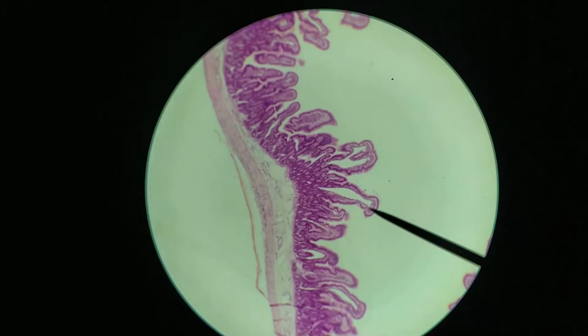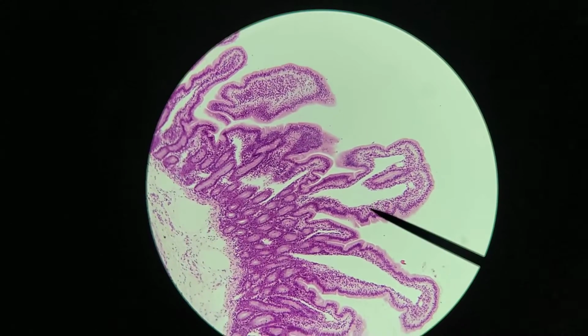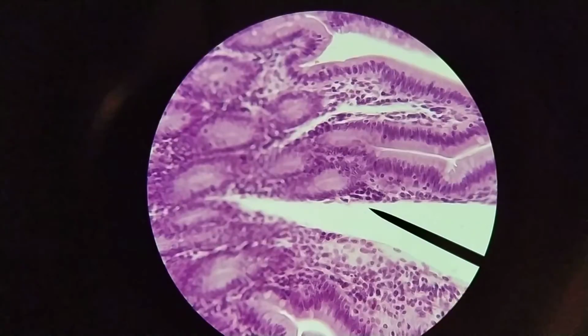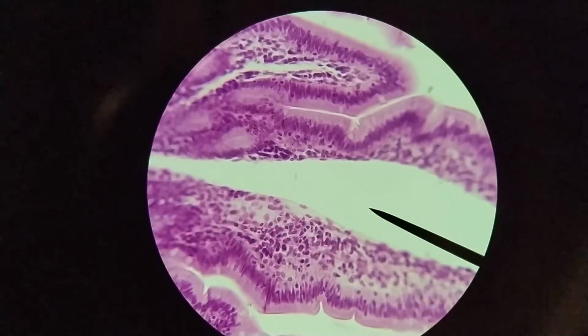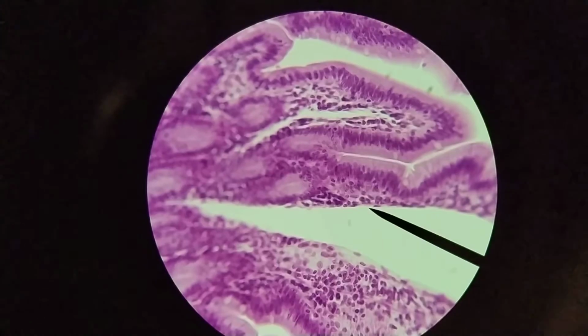Now let's zoom in on some of these villi just to see their overall structure. One of the things you'll notice is that the interior of these villi looks fairly empty. So here and here, what you're looking at are actually lacteals. These are lymphatic vessels that run through the middle of the villus. So this kind of looks empty. There is an epithelial cell right there. There's an epithelial cell right next to the pointer here as well.